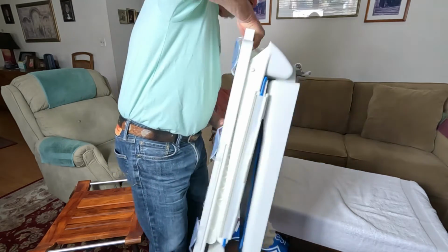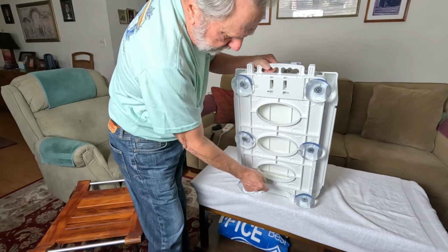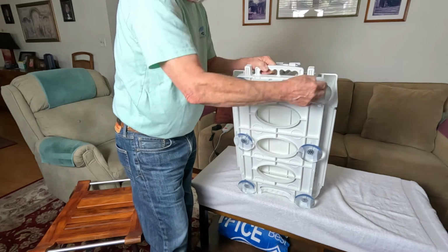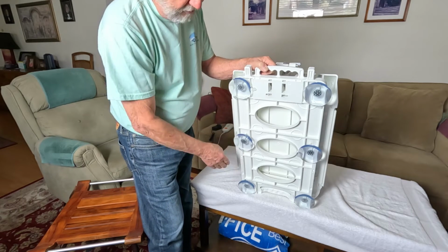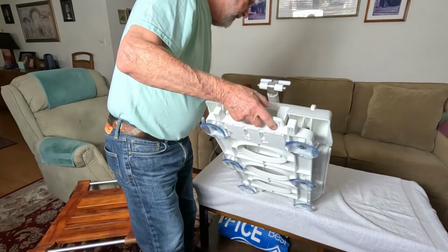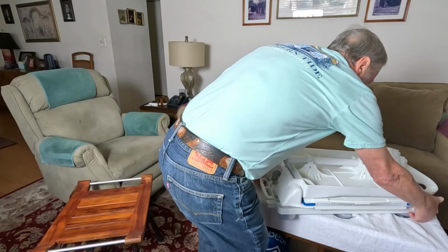Okay, and here's the other thing. While I've got it up in this position, I'm just going to set this down just like that. It has suction cups on the bottom, 6 of them. These right here are how you help remove it by pulling on this. It breaks the seal with the tub, and that's what that's for. You can mount this on any kind of floor, rug, carpet, wood, tile, and it'll work fine. All right, now we're going to put this back into position, and we're going to demonstrate the operation of it.